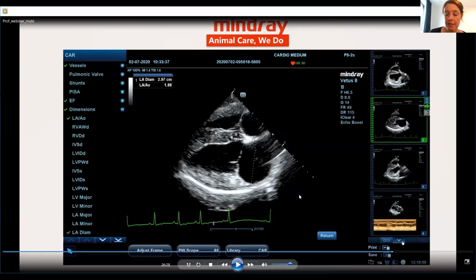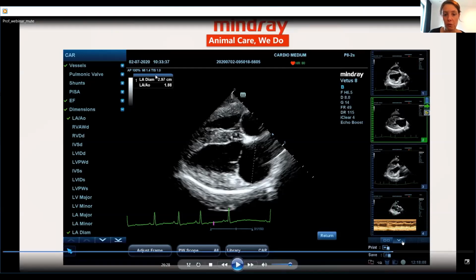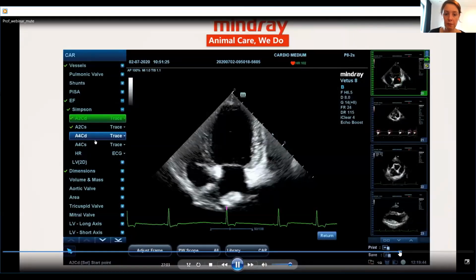What I want to say here is that this measurement is particularly useful in cats. When you want to assess left atrial size, when you want to decide whether a cat has dyspnea from cardiac origin or from respiratory origin, it is always a good idea to do this measurement, because it's often, when you begin to do cardiac ultrasound, more reproducible and easier to measure than the LA/AO. And the cutoff for normal left atrial size in cats is approximately 16.5 millimeters. Okay, this is a dog, so it's allowed that this dog has a bigger left atrial size. Okay. I think that's it from the right side.